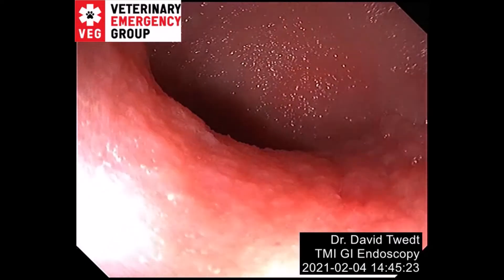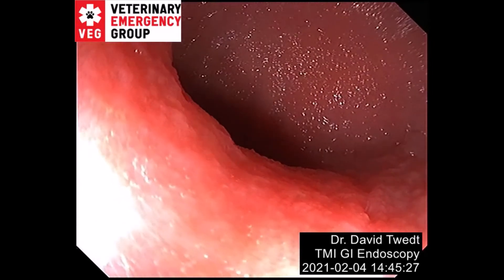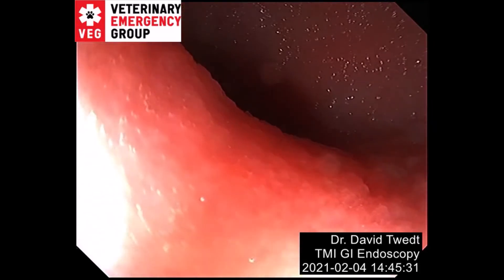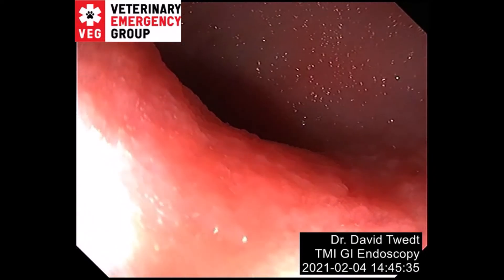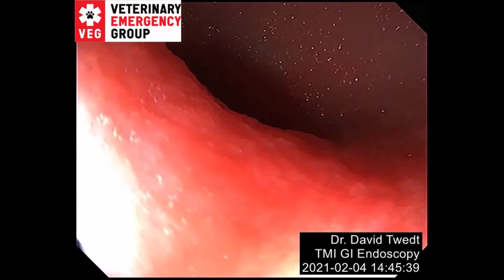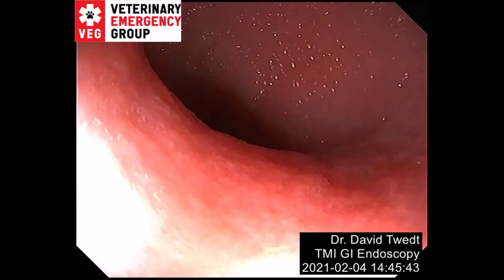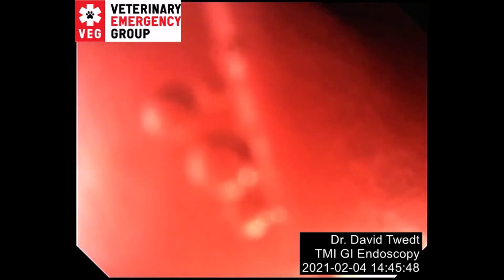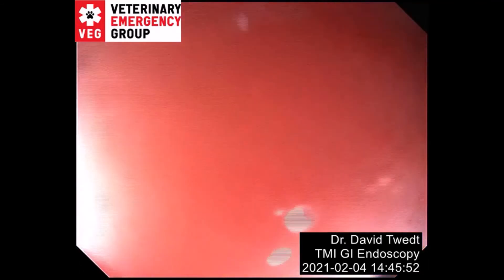A lot of that is your mind's eye, knowing your anatomy and where you want to go — what your plan is. Now it's just a matter of zooming down, and it's a lot like a water slide. You understand from the anatomy there are various flexures; you will hit them and it looks just like this. In your mind's eye you say, that's a left turn, so I'm going to go on that part of the water slide. You'll lose your lumen a little bit as you go around. Boom, boom, boom — down. You take your biopsies and as you're coming back you'll get a better look.